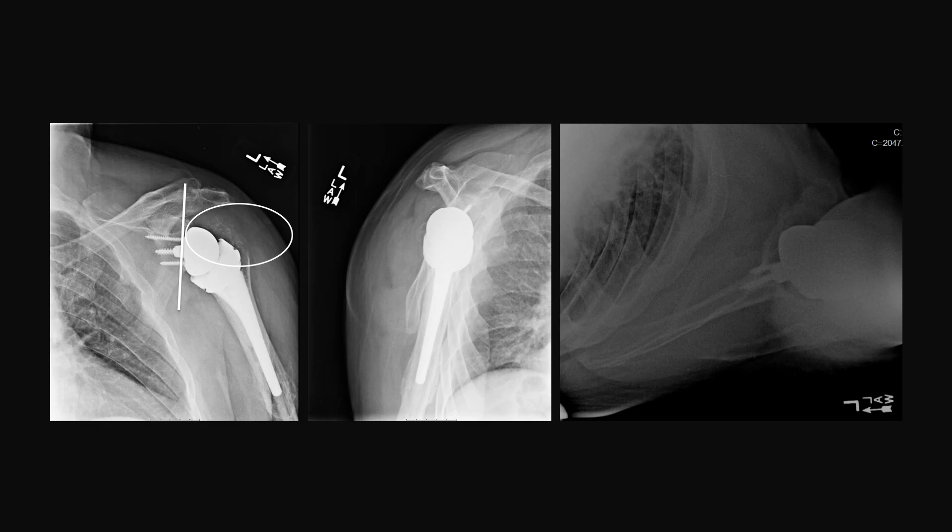As you can see postoperatively, we've corrected that superior inclination that was originally planned when we anticipated anatomic total shoulder arthroplasty. In addition, you can see where we damaged the greater tuberosity in removing the nail and had to convert to a reverse total shoulder.